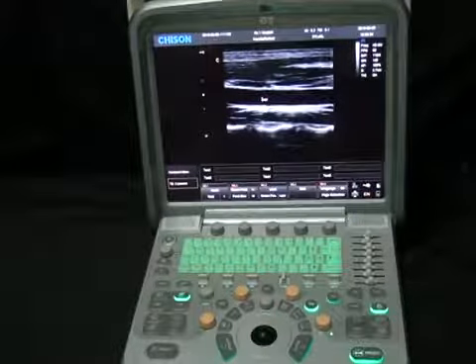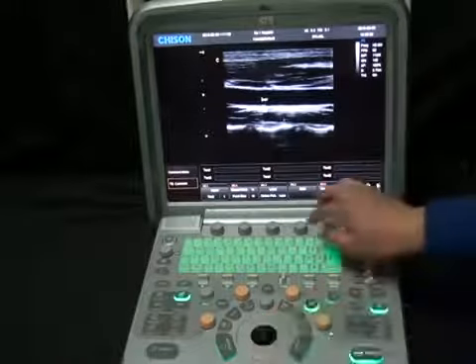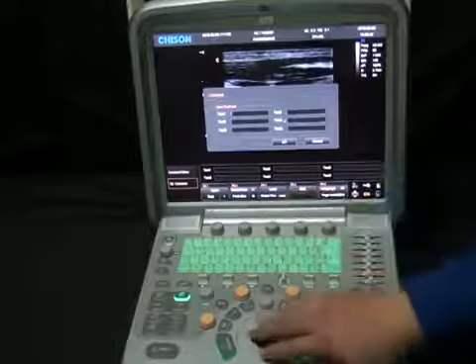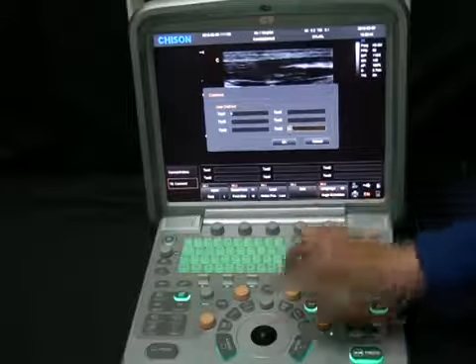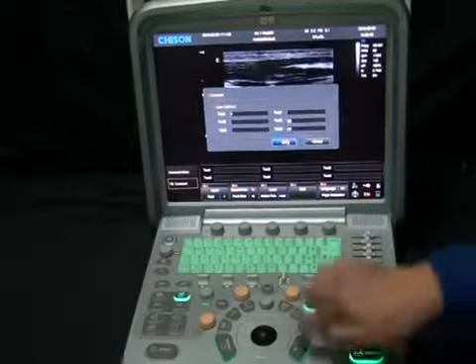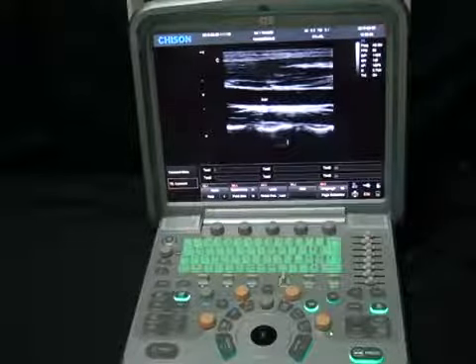We can also add our own quick comments. Here at number 4, we click Edit, and it will allow me to add 6 custom comments that would come down right here for quick use. You would enter it here. Click OK. So if you would want to add that, we'll use this input.